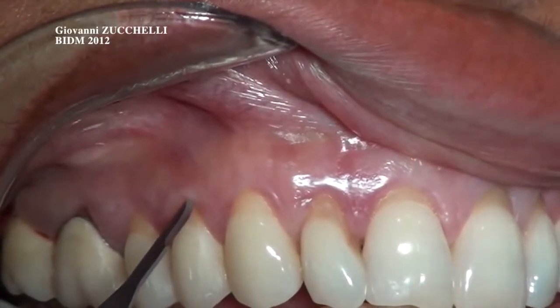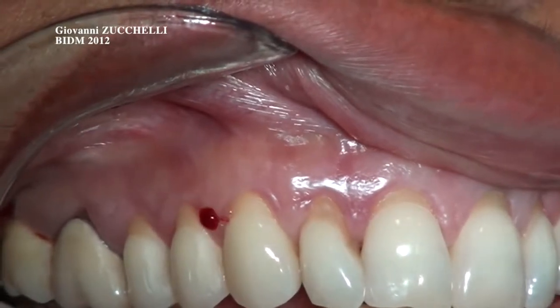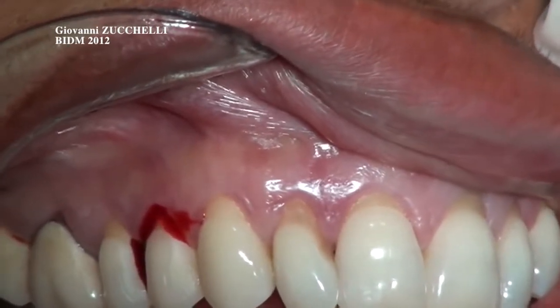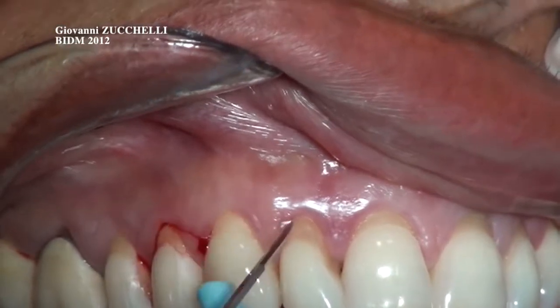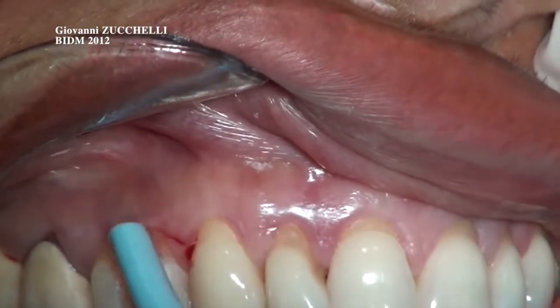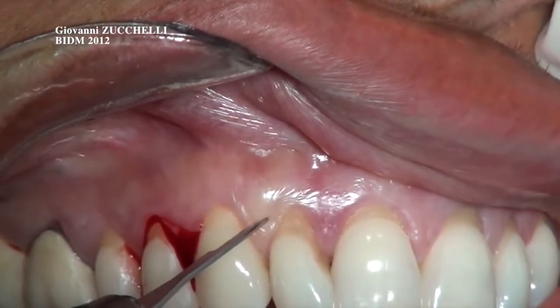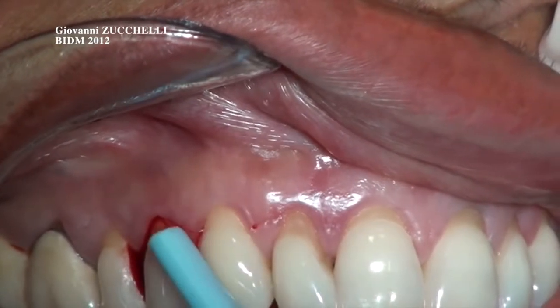We go from the premolar towards the canine, just making a bleeding line, and this bleeding line is called the incision design. Now we make a second line. This is the second incision.